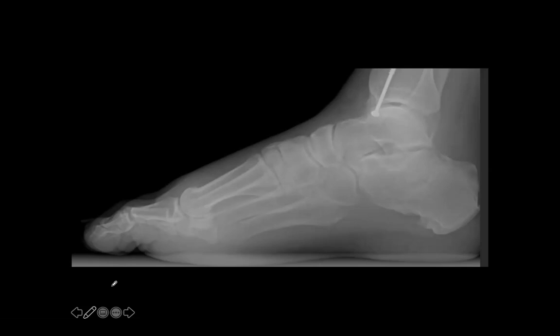But I just want everyone to know, when you look at it, you'll see different resources that talk about angle of Gissane being increased or decreased. Don't get confused by that. Just understand that it really does depend on how the posterior facet tips, because it can tip in different ways. All right, do you want to go over what we see abnormally on the calcaneal axial here, Suki? Sure. It's kind of tough to see on here, but what we saw was 2 fracture lines, and we classified this as a Sanders 3AB.